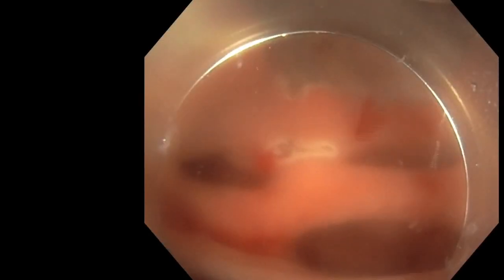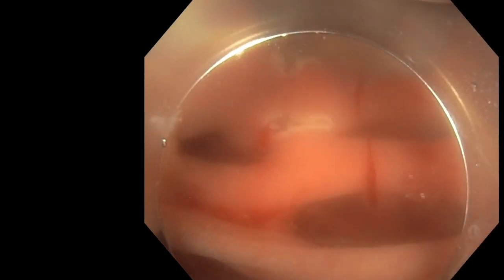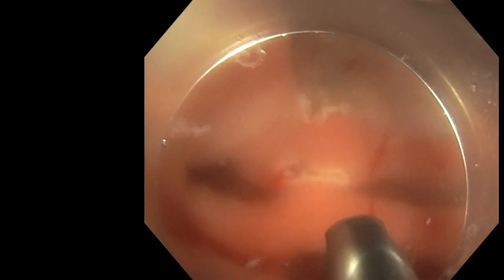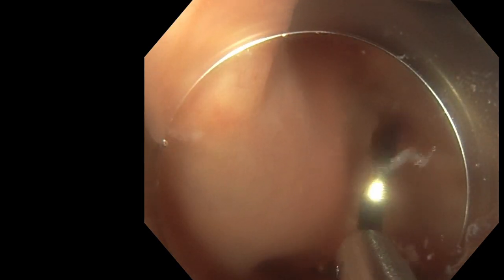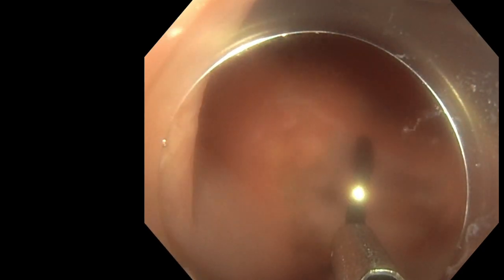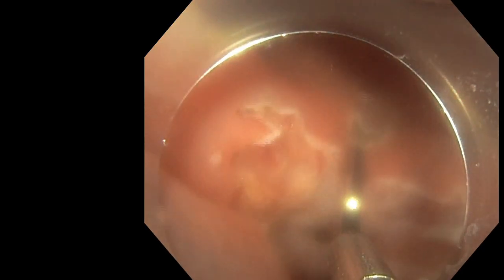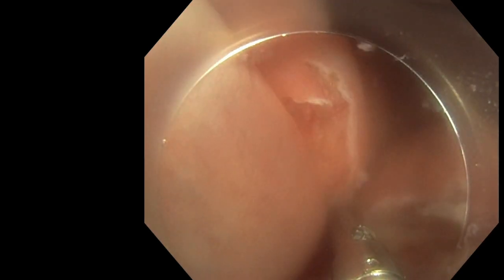And the clip is coming now. I use my 2 incisions to close it.